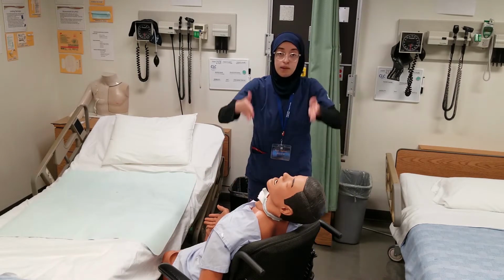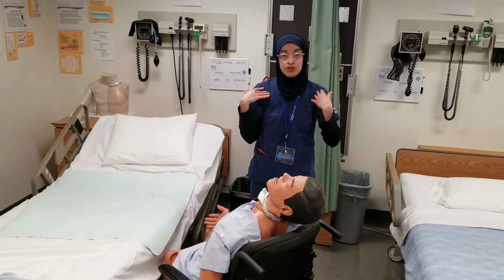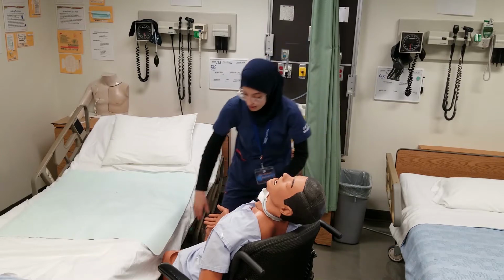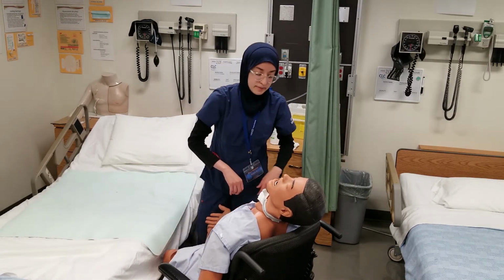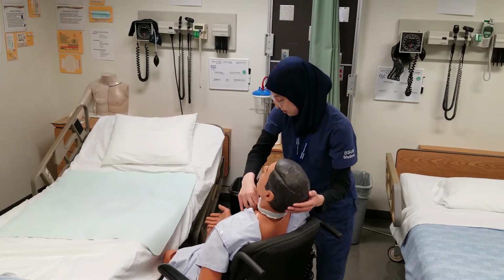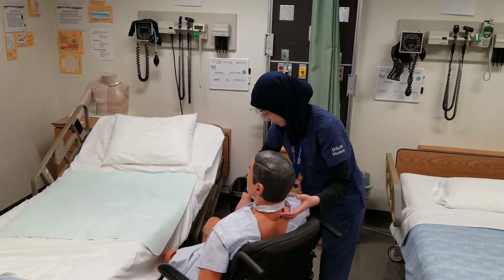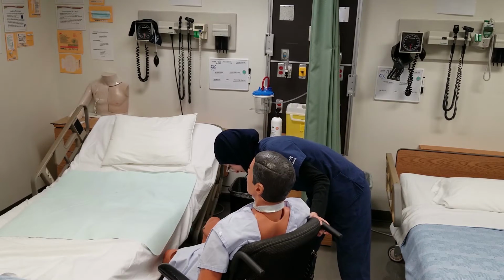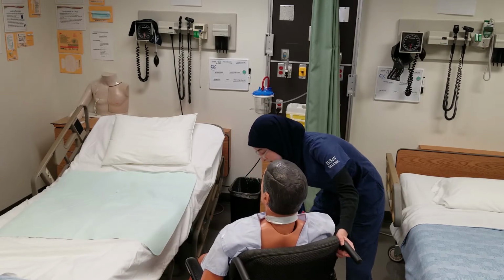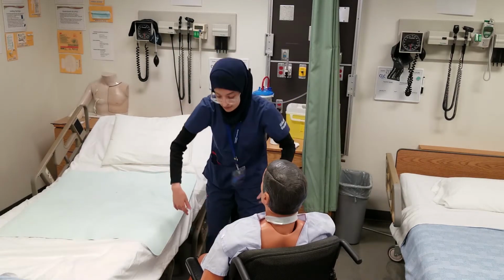I want to make sure that he's not leaning to the side. We want to make sure that he has proper alignment, so his head is in line with his shoulders, which is in line with his hips. And then I'm going to see if there is any seatbelt. I want to make sure that I'm clipping him in. And then I can move the chair at this point. That way I'm able to move the footrests back.